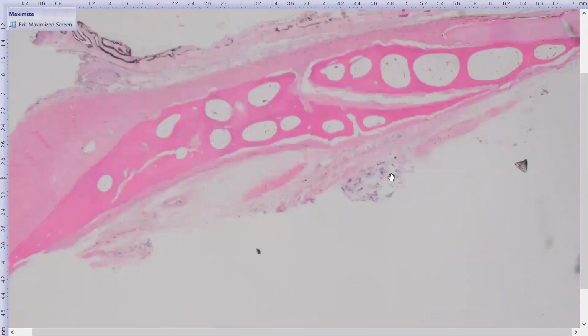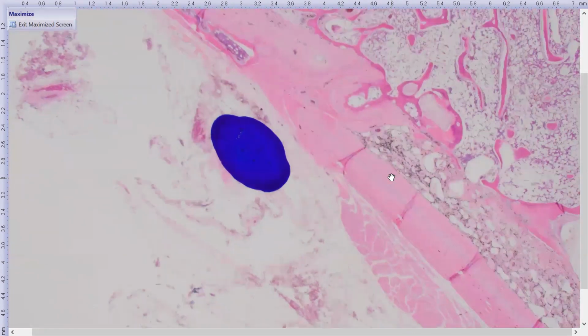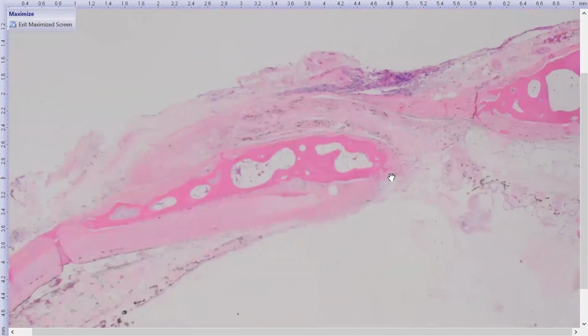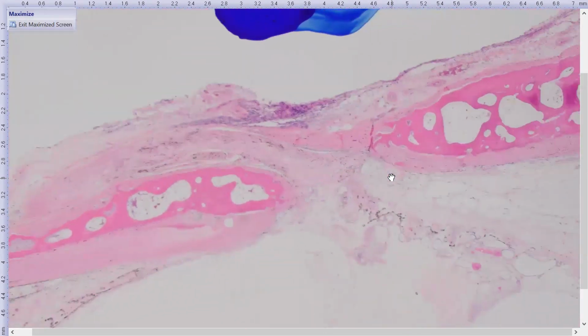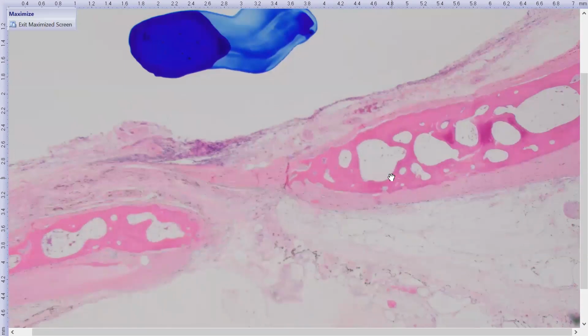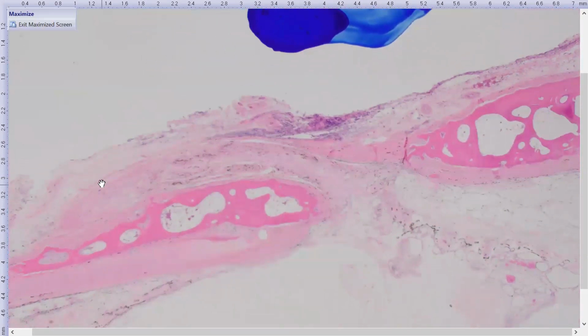And then I'm going to go around this way. And so this is the scleral ossicle. This is the normal bone that is found in avian eyes. And it is also discontinuous here. I don't know why I'm trying to use the arrow on the scope. Discontinuous here, and we've got actually prolapse of uveal tissue coming out through the fracture site.